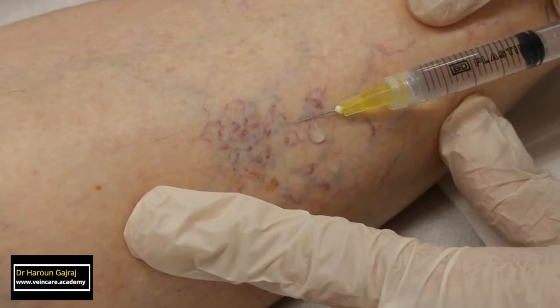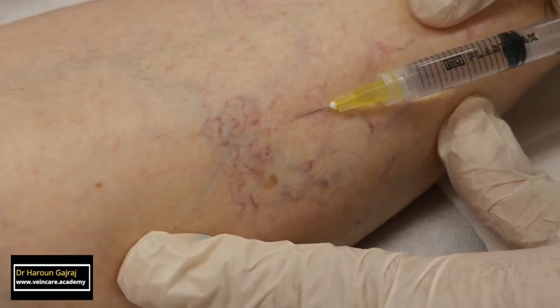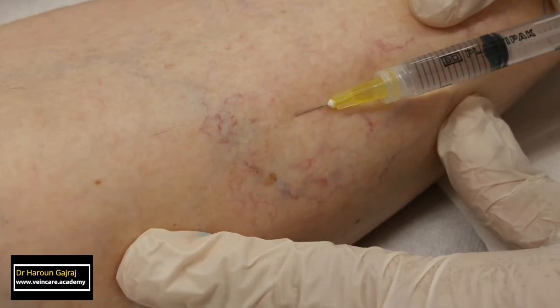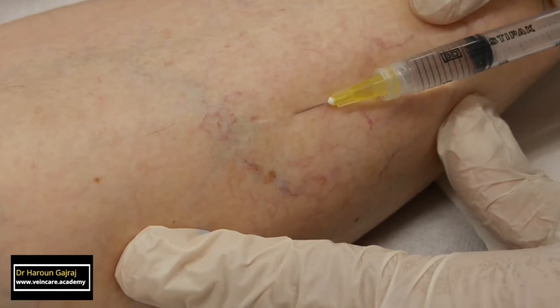The leg veins appear to disappear. Of course, what is happening is that the blood within the vessel is being displaced by the clear liquid sclerosant. It is certainly a very dramatic appearance, but the spider veins have not disappeared.